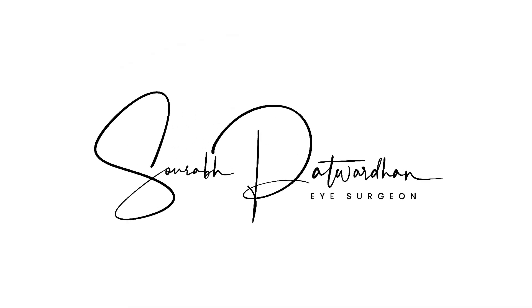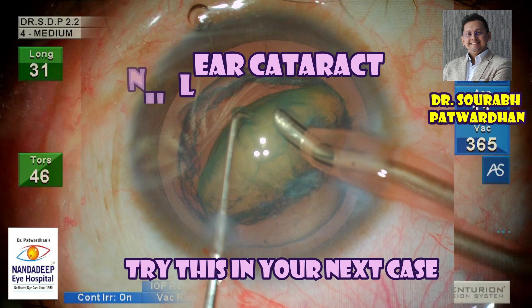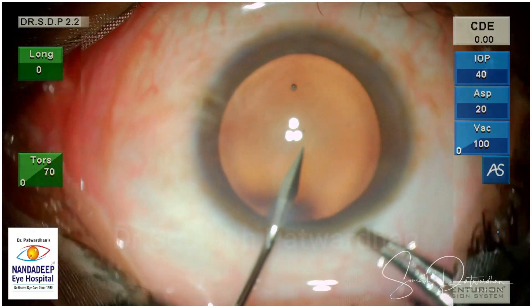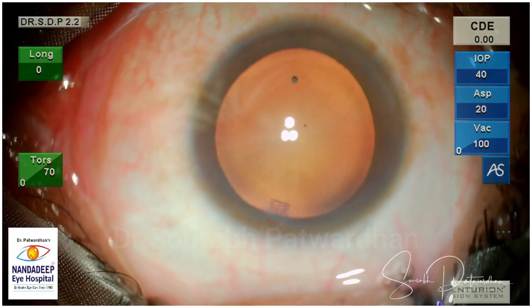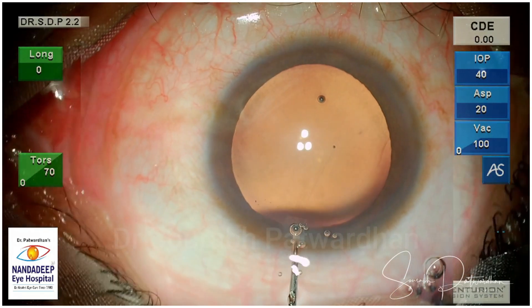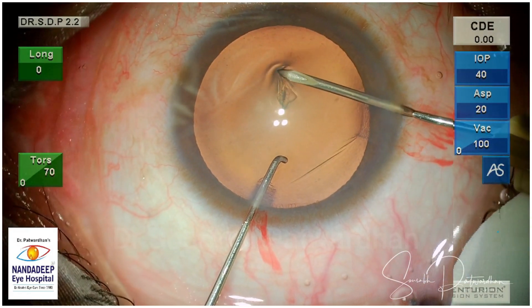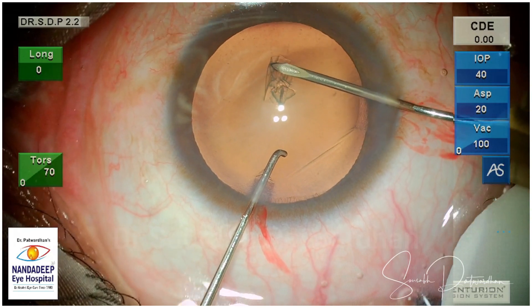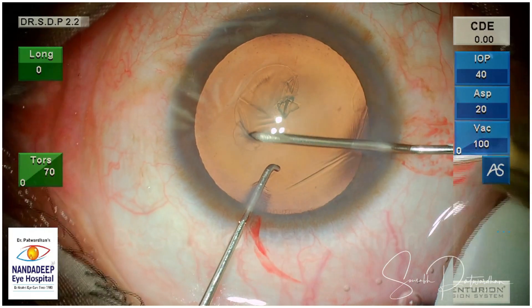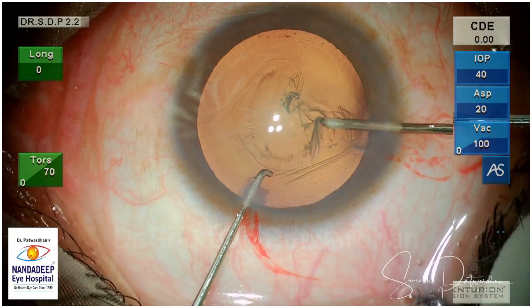In this video, I am going to show a technique to manage nuclear cataracts. If nuclear sclerosis is grade 1 to 2 and it is purely a nuclear cataract, you can try this technique. This technique requires a good CCC as in any other case — it should not be too small, so we should avoid a capsulorhexis less than 4.5mm. After doing a good CCC, there are 3 key steps in this technique, and we will watch them one by one.